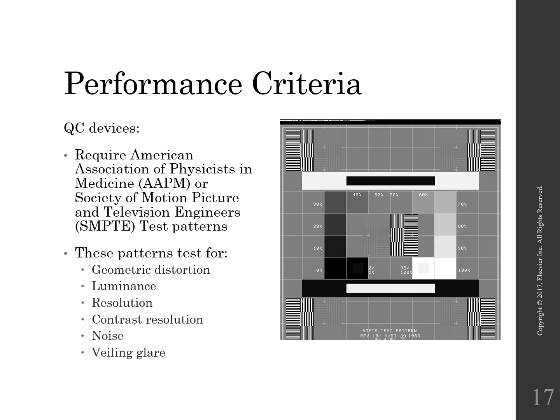So, like I mentioned before, the attention that we pay to imaging and viewing soft images on these displays has required a lot more performance criteria and more guidelines or requirements as to what these displays can do. So one of the ways is that they have produced some different options for monitoring the display's performance. There's a couple different groups that are actually in charge of developing these quality control devices.